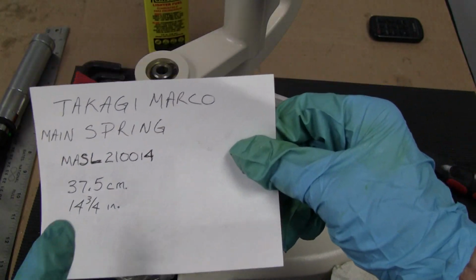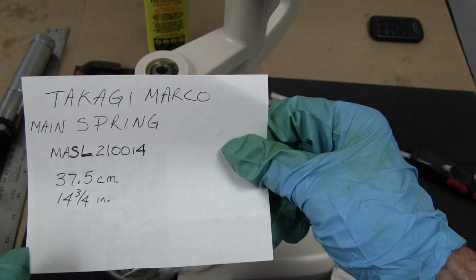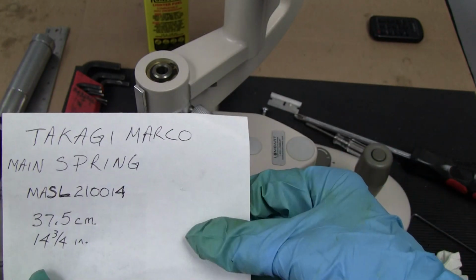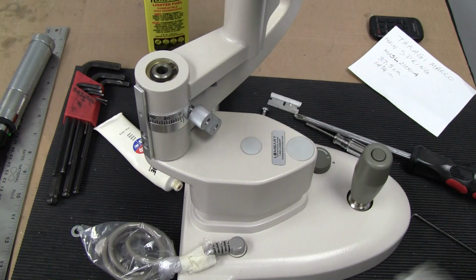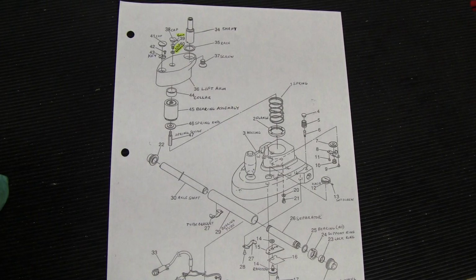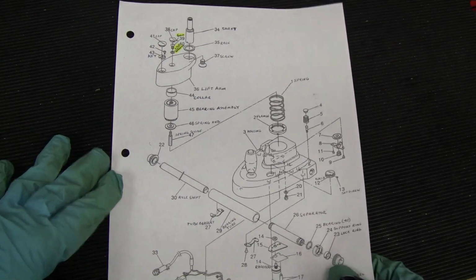So just a reminder, I think this is the number of the spring, and this is the length of a new spring. So you can compare your new spring with your old spring to see. I just wanted to show you a quick diagram of the parts.